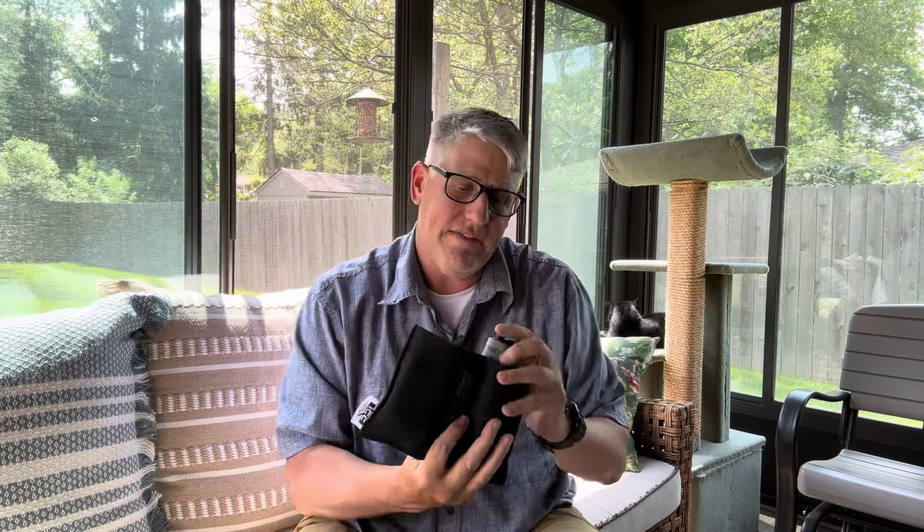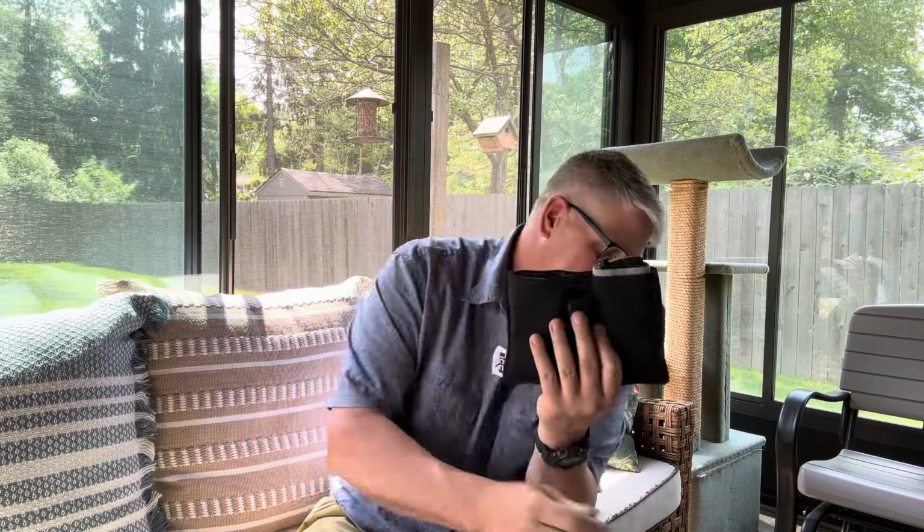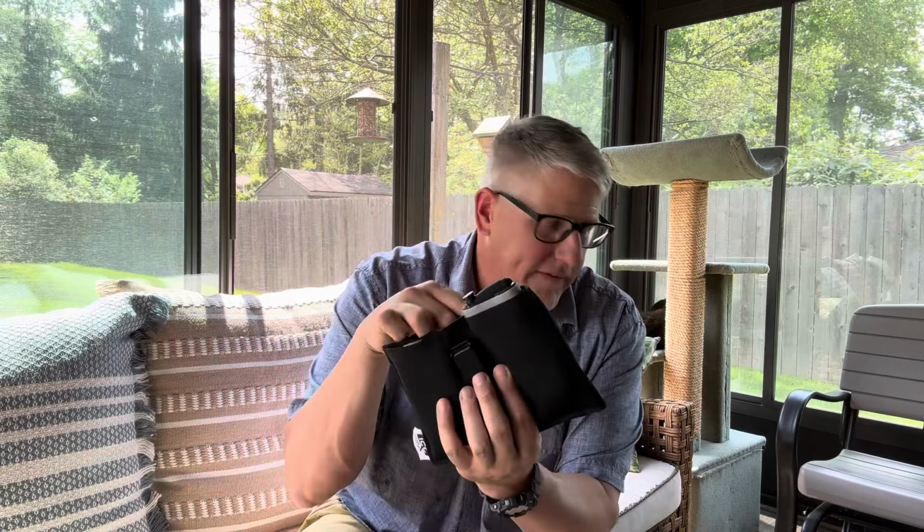Next step down would be this option from Immediate Casualty Care. And I'm going to show you how this would be set up. They have 3 configurations from this company, and I do really like this setup. So this company offers a setup that is 1 width wide with a clip, this double width wide, and then one that is a little bit wider with 2 clips.